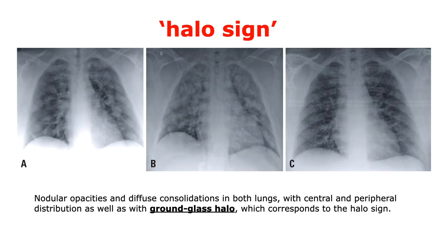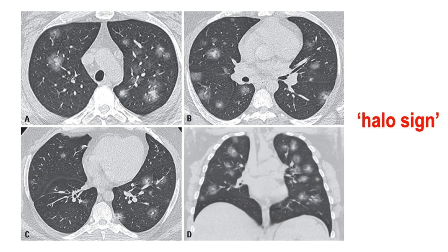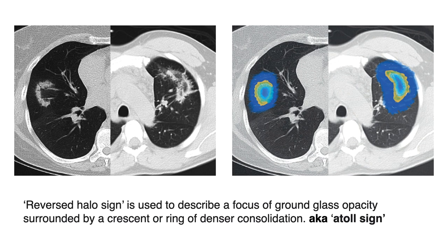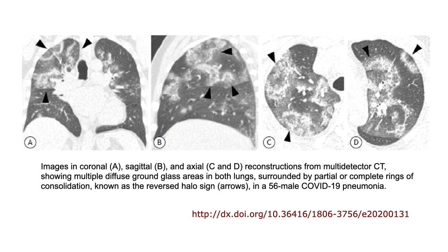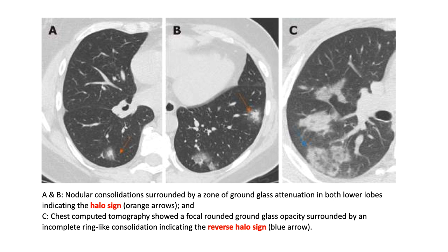Coming to halo sign and reverse halo sign. Nodular opacities and diffuse consolidations with central consolidation surrounded by a ground glass halo give a halo sign — seen in all four images as central dense white consolidation surrounded by ground glass opacities. The reversed halo sign — also known as atoll sign — is a focus of ground glass opacity surrounded by a crescent or ring of denser consolidation. Both signs can be seen: halo sign in yellow and reverse halo sign in blue.